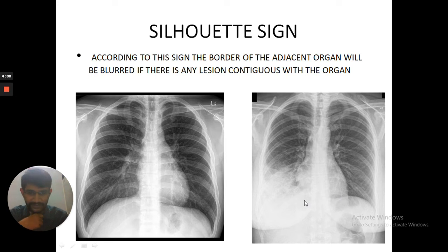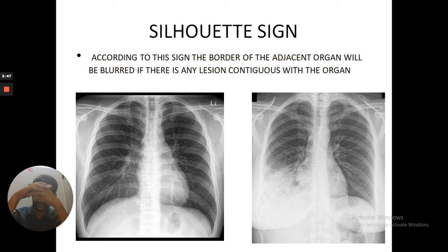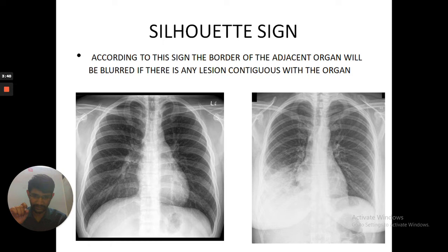On the X-ray on the right side, you can see the diaphragm is not clear on the right side but is very clear on the left side. These are the lower lobes, and here comes the diaphragm. There is lower lobe involvement, so the diaphragm border is blurred — that means there is a diaphragmatic silhouette sign. The diaphragmatic border is silhouetted, indicating involvement of the lower lobes.